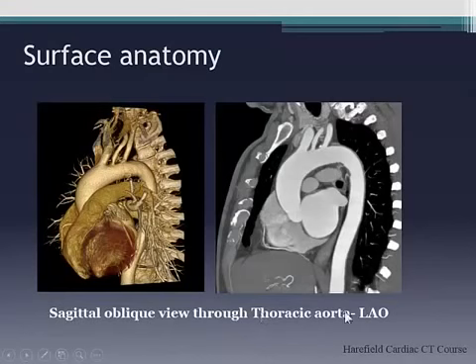So when we're looking at the aorta, remember the aorta, in the same way as the heart, lies in a double obliquity plane. So we often get this candy cane or hockey stick view, for example, on MRI. The way that you plan it on MRI is you can either do a three-point plan, but if you don't have that, you can cut through the ascending and the descending aorta, and usually that cuts through the aortic arch. Obviously, if it's very unfolded, if it's very tortuous, then it's going to be difficult to get it in a plane. But the advantage of CT is you've got the volume.